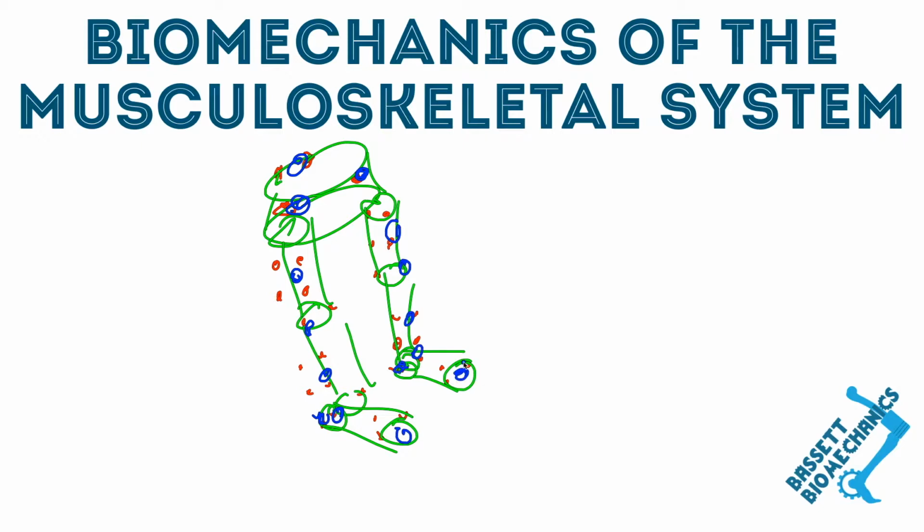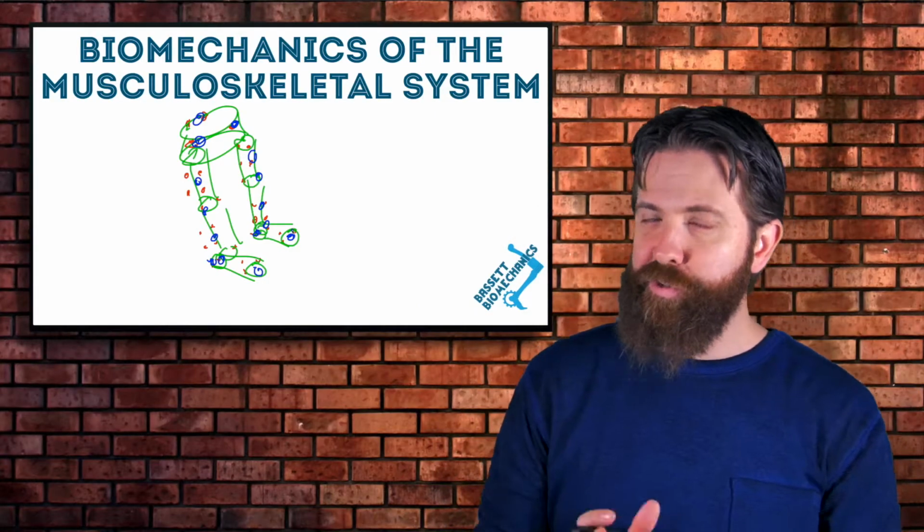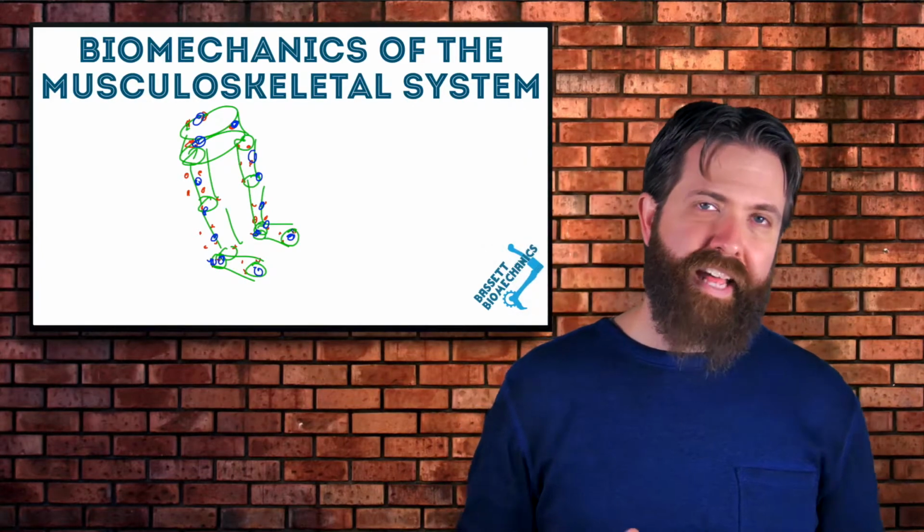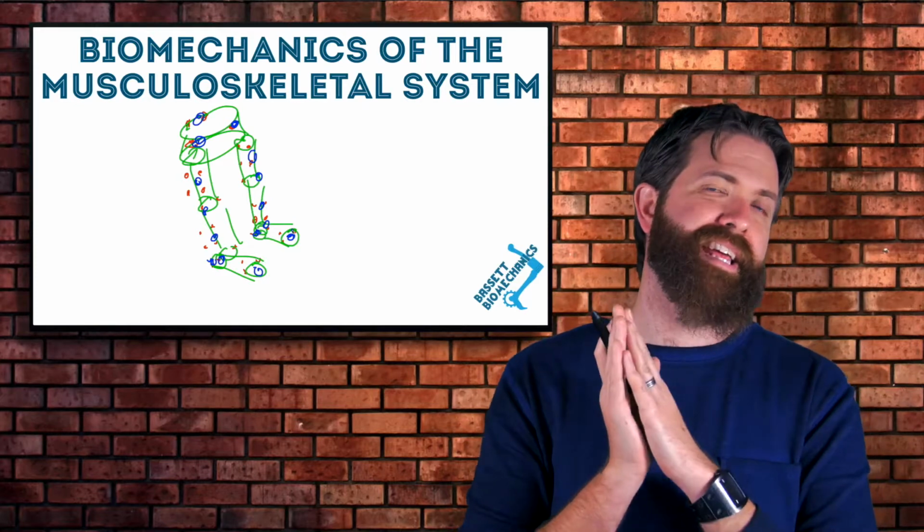Clearly, many fewer markers. One of the reasons to use the conventional gait model, frankly, is a reduced number of markers. This has a huge impact on your data, and that's what our focus is on in this unit.